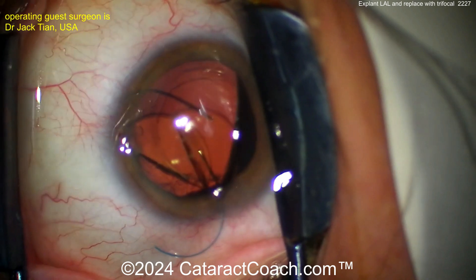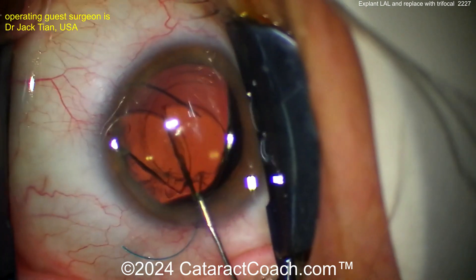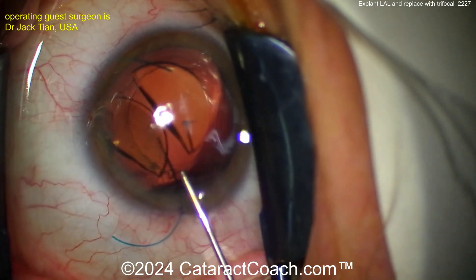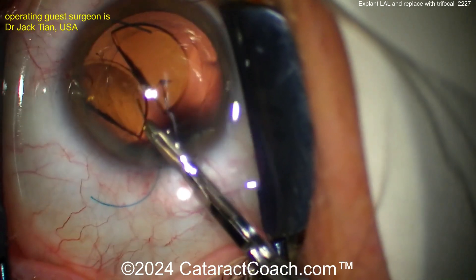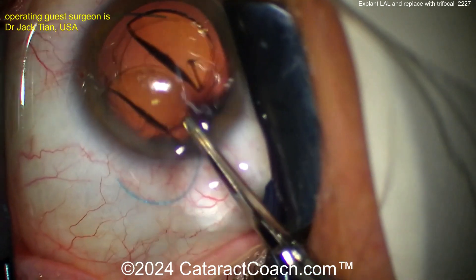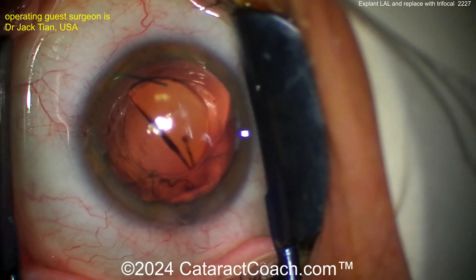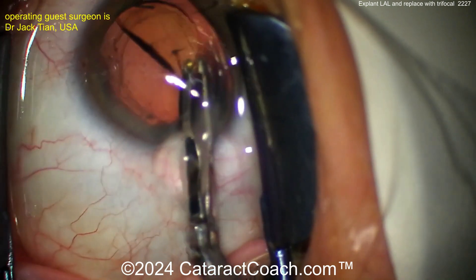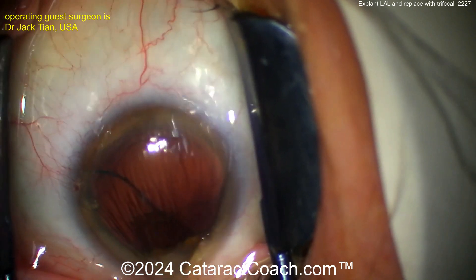At this point you can bring each half out — make sure you get the complete half including both haptics out of the eye. Now let's talk about why the patient wasn't happy. It all comes down to expectations. This is a monofocal lens, and some patients really want that near vision. The best way to achieve that oftentimes is by using a trifocal lens.